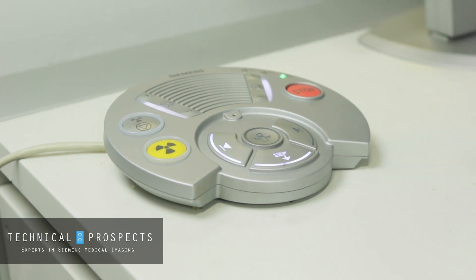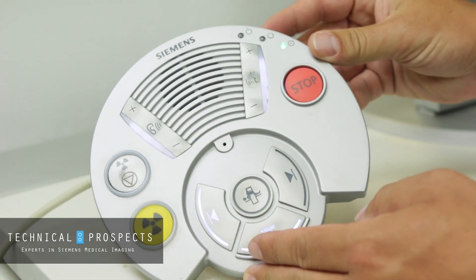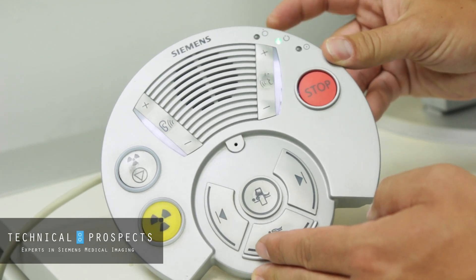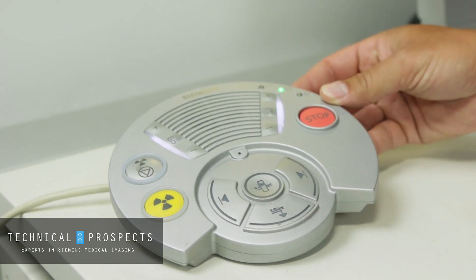When you're first coming into the site to service the gantry, the first thing you want to do is use the middle button on your system control box here to turn it to computers only. This starts the process of powering down the system gantry properly.